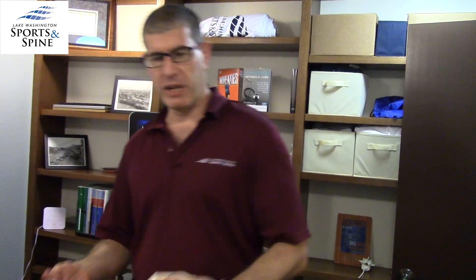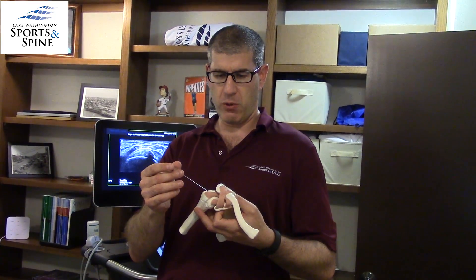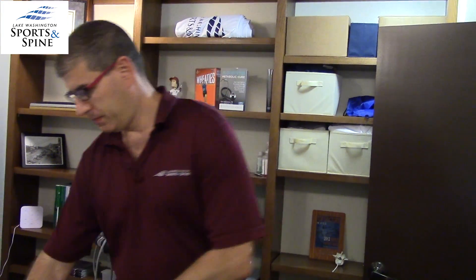What this involves is using ultrasound guidance so I can see where the calcium deposit is, directing a needle down towards that deposit, and then blowing it up from the inside. The idea behind this is that the calcium deposit isn't uniform — it's like a gum that has a hard outer coating and a jelly-like interior. So if you can get a needle to the inside of the calcium deposit and blow it up with fluid, you can actually pull a lot of the calcium out.